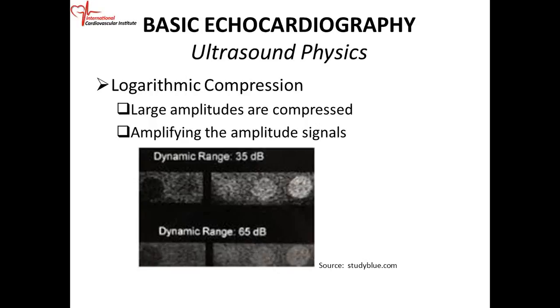At the higher dynamic range, there's not much contrast between the different grays. At the lower dynamic range, there's more contrast, and you can distinguish the structures more.